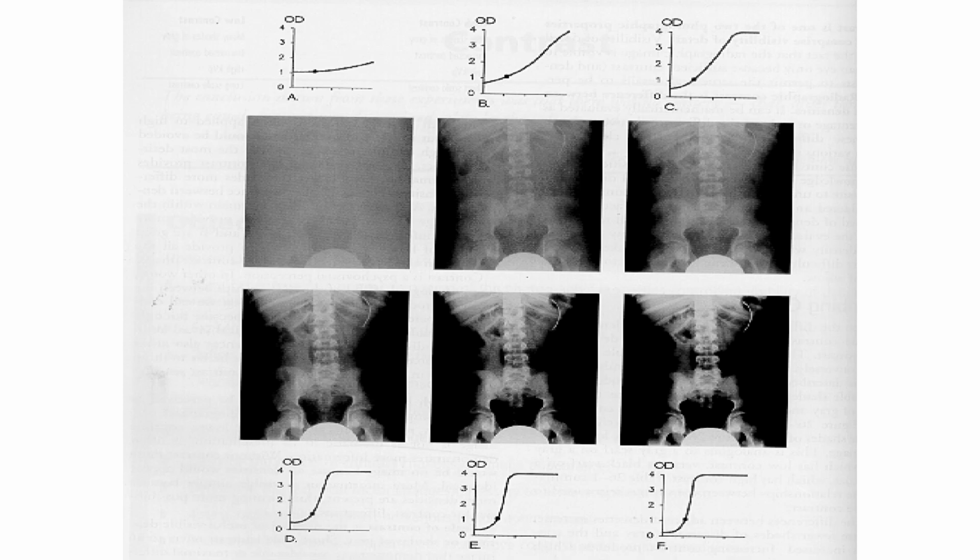Well, let's just say which of the images has the best contrast. The image is a plain film abdomen.